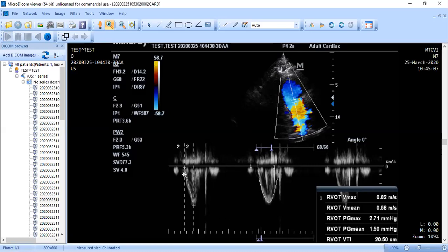And then we're going to do another measurement called pulmonary artery acceleration time. And we're going to put a little cursor here. And then we're just going to slope down to the point of that waveform right there. We'll go over all these measurements again in the future, but I'm just trying to show you exactly what we're going to do in each and every one of these views.